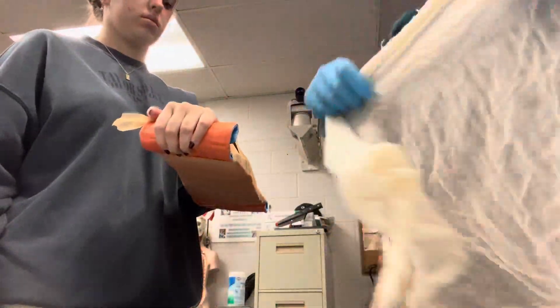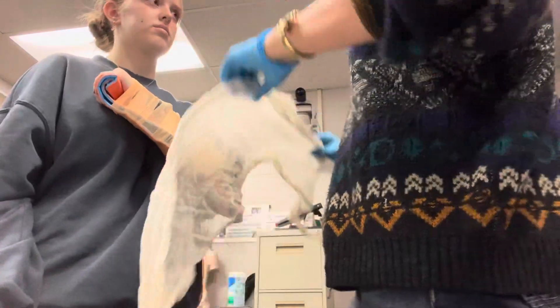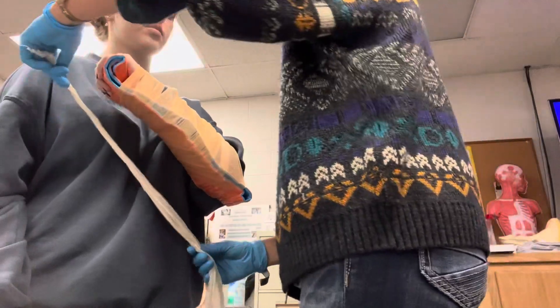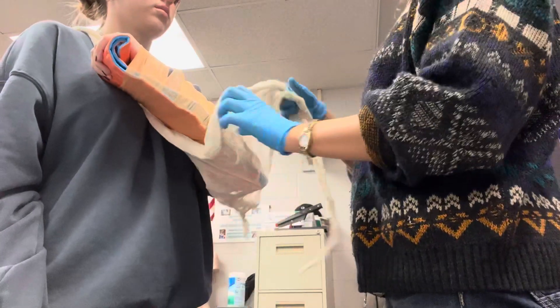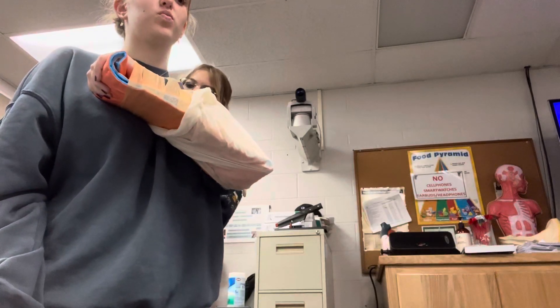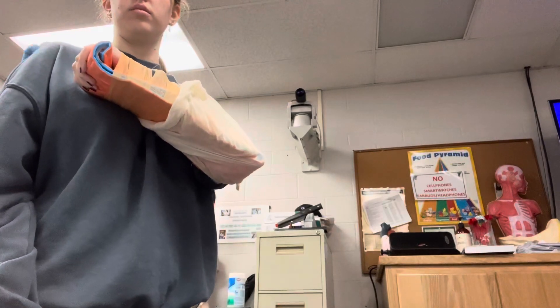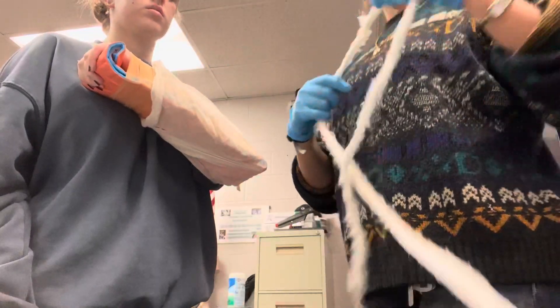I'll have her hold it in a place of comfort against her arm, or hold her arm to her chest. Then I'll go underneath as carefully as I can, trying not to make any uncomfortable movements, putting the knot right at her elbow. Going below, immobilizing the bone. So, up against her chest. I'll splint it to her body, immobilizing it.